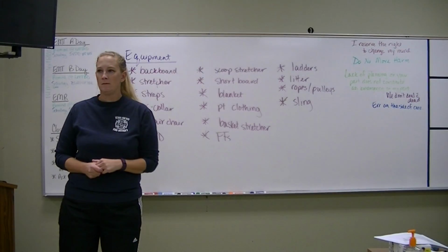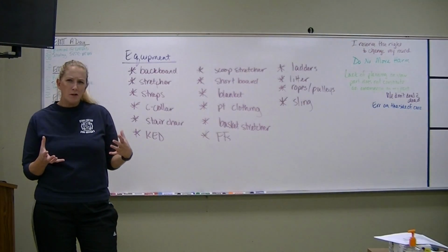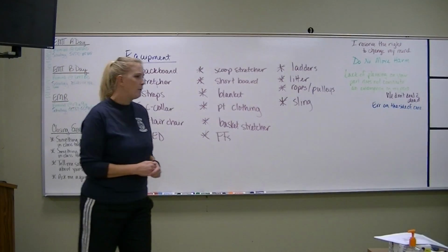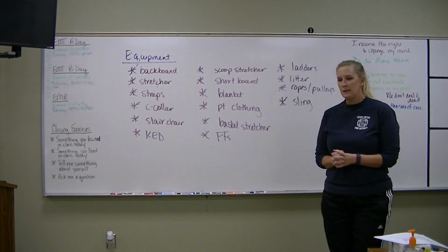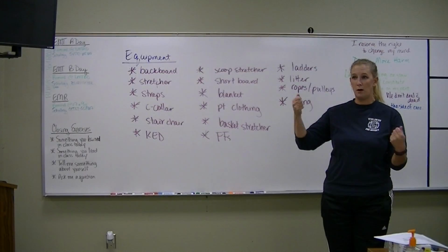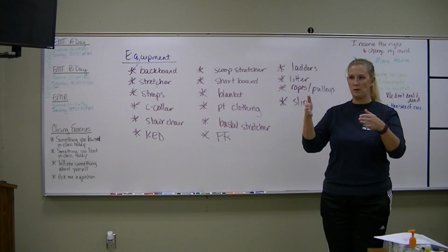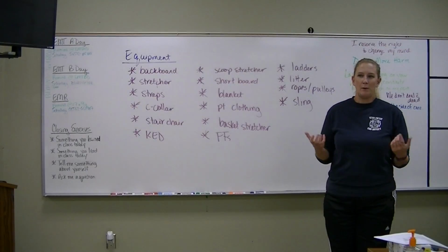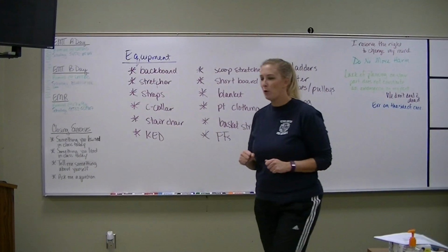Okay. What are backboards made of? Plastic or wood, okay, some kind of rigid material that's kind of tough because you can pick people up on it. I went out to Canyon County Paramedics, this is several years ago now, and the Caldwell Fire Department had taken one of Canyon County Paramedics' backboards, one of the long rigid boards, not like the one that I showed you earlier that curves up, but just one of the long flat ones. They needed a short board to get to a patient, and Canyon County Paramedics didn't have a short board on, so they just sawed right through it. So then they had two halves of a long board. It was kind of cool.